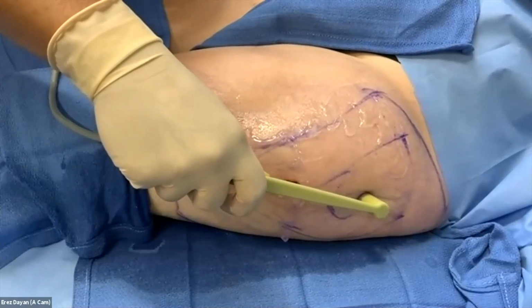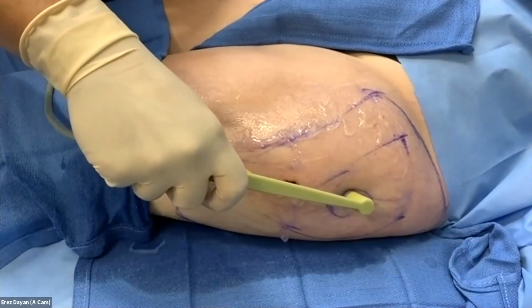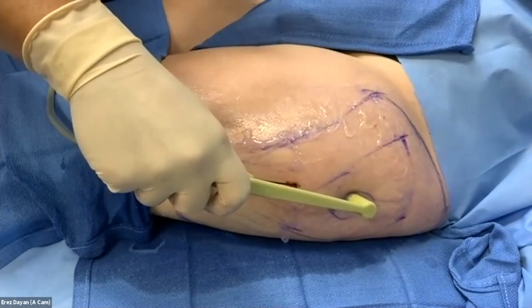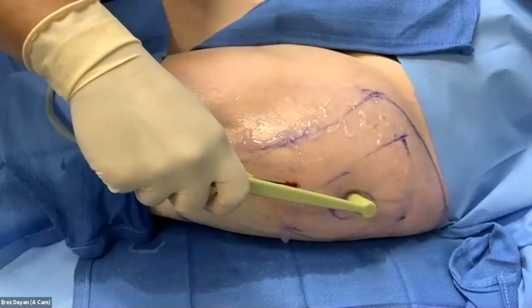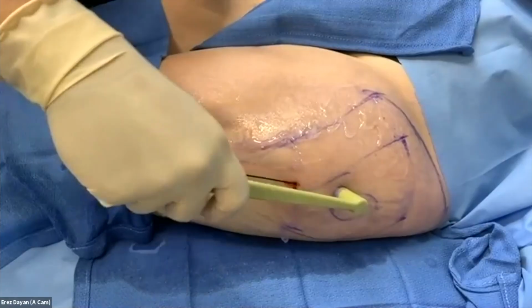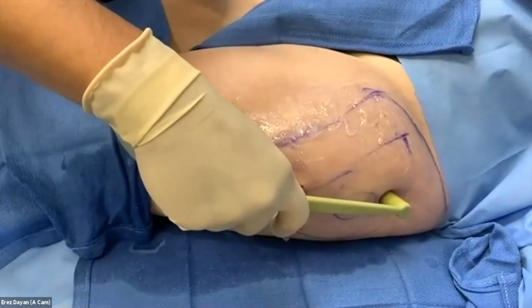Do you feel any of that on the edges? A little bit. So I usually go a little past where I want to treat, because the heat signature is going to travel about half a centimeter past the device, so you just want to be cognizant of that. Notice how I'm cantilevering down. I'm not kind of doing this, especially when you go over a curved area.